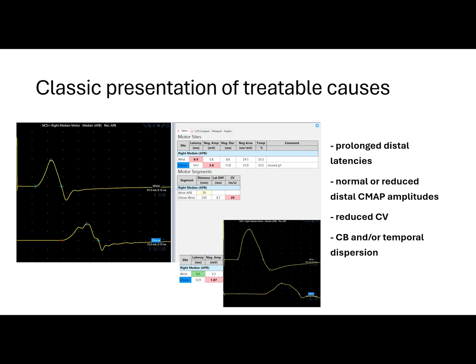Now I'm going to shift gears and show some patterns that should raise the index of suspicion of a treatable neuropathy. In this example, we can see a classic presentation of CIDP — chronic inflammatory demyelinating polyradiculoneuropathy. We can see a right median motor nerve conduction study with prolonged distal latencies, normal amplitudes at 5.8, and reduced conduction velocities at 29 meters per second, also with temporal dispersion. In another patient, we can see an example of conduction block where the motor amplitude dropped from 5.3 to 1.87 millivolts. The diagnosis of CIDP requires a combination of clinical and electrodiagnostic features with exclusions to eliminate other disorders that may mimic CIDP.